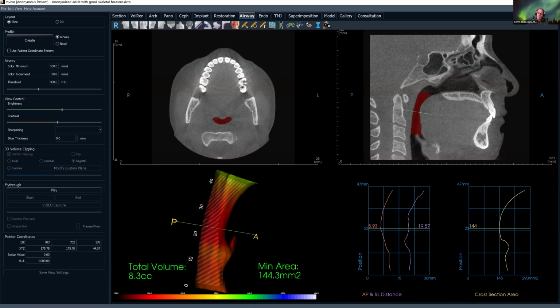Here's what happens. Commonly, teeth that are susceptible to vertical root fractures are either restored or have endodontic therapy already. That gutta percha is highly attenuating and it creates a lot of artifact in the area, so it makes it much more complicated to diagnose vertical root fractures.